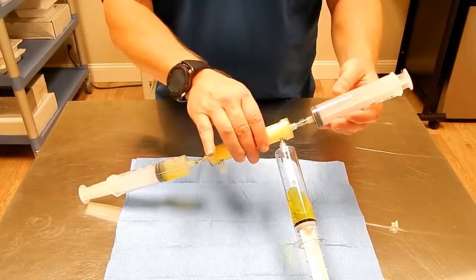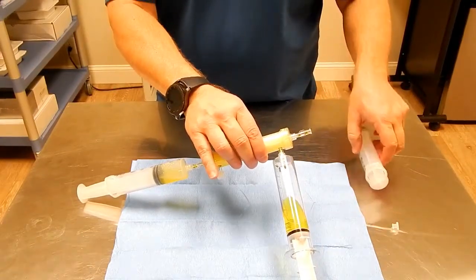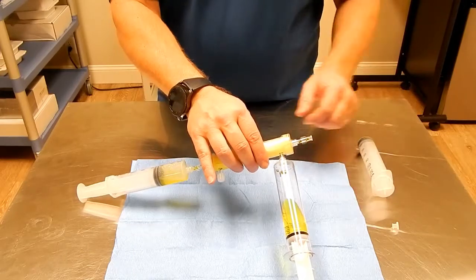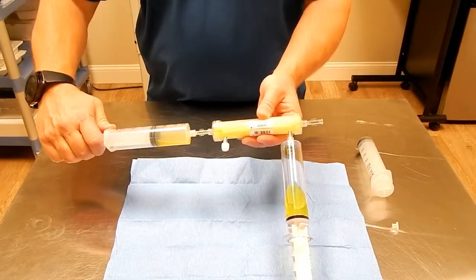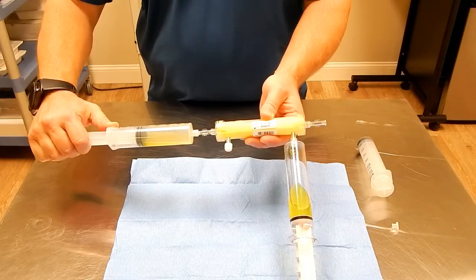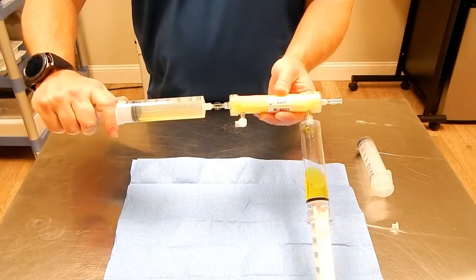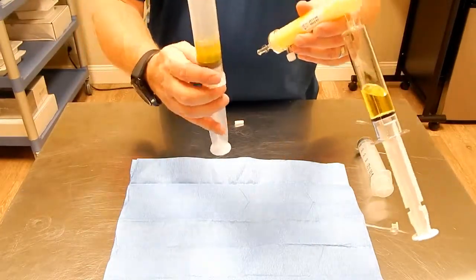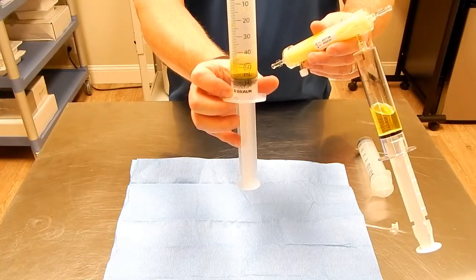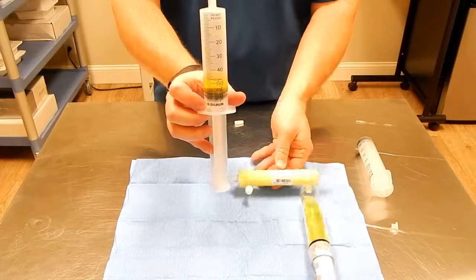At that point, we remove our extra syringe and pull back the remaining fluid that is in the syringe and in the concentrator, to leave us about 12 to 15 cc's of A2M Concentrate.